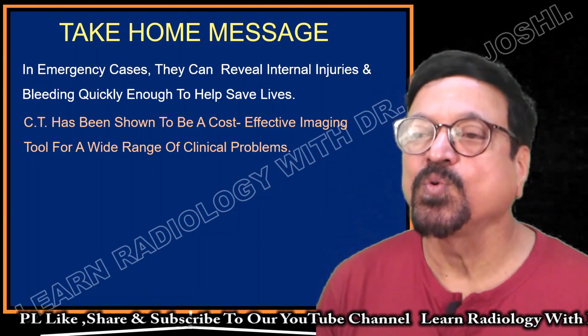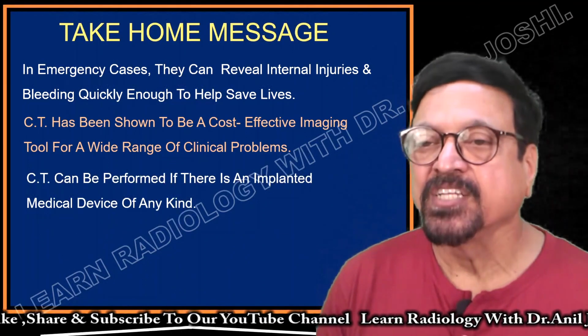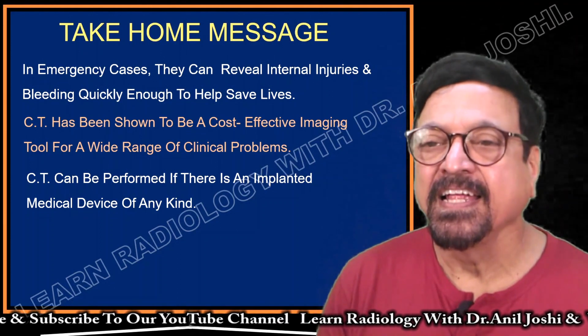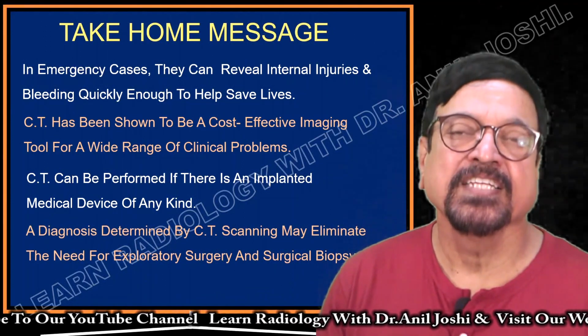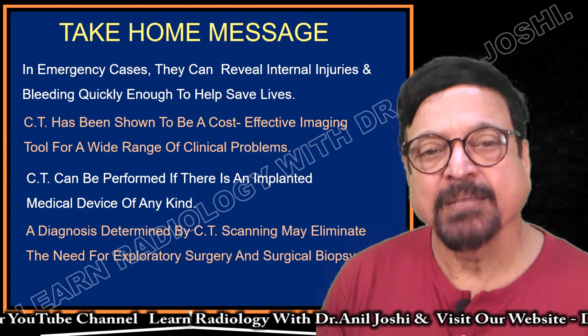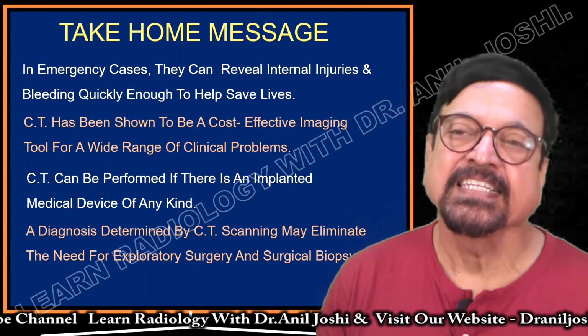CT has been shown to be a cost-effective imaging tool for a wide range of clinical problems. CTs can be performed even if there is an implanted medical device of any kind. What does it mean? Suppose there is a fracture treated with metallic prostheses, or there are any clips, still a CT can be performed.